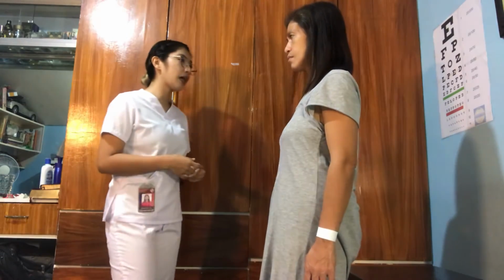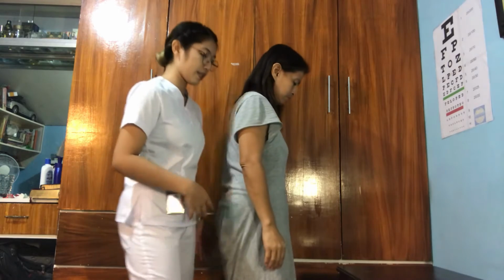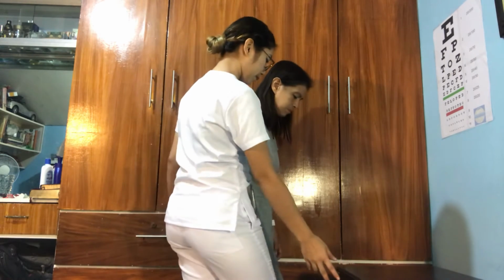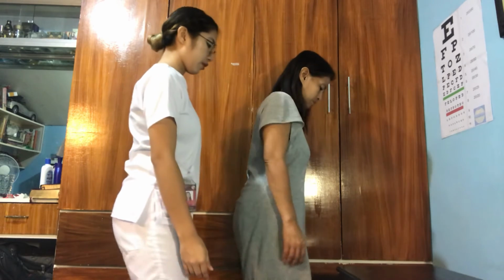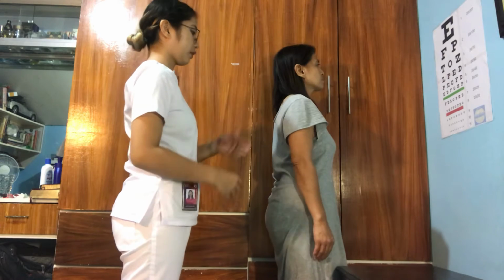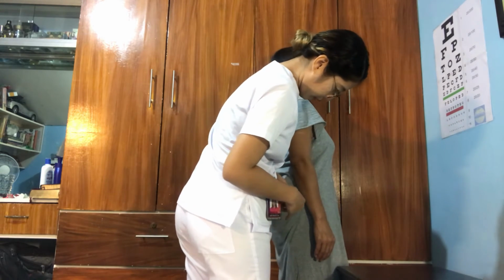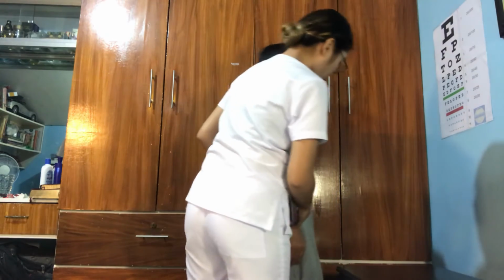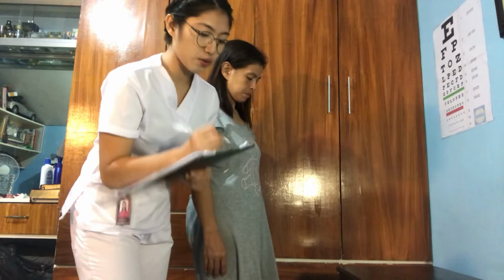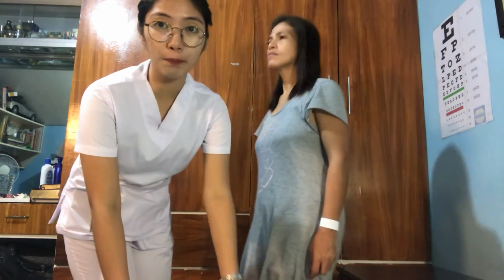So, Mrs. Tia, isusukatin po natin yung weight natin. Tayo na lang po tayo sa weighing scale. Okay po. Diretso lang po. Okay, tingin po sa diretso. Okay, okay na po. So, yung weight nyo po is 53.6. So, isusulat ko lang po dito. So, the weight of the patient is 53.6.